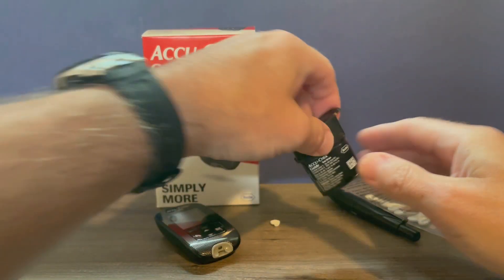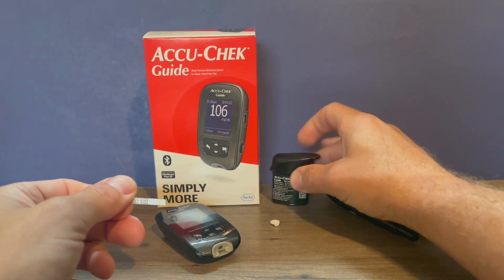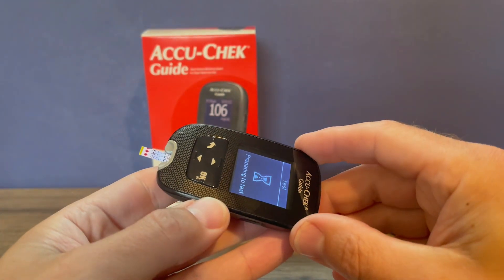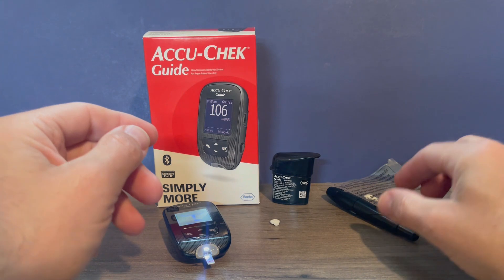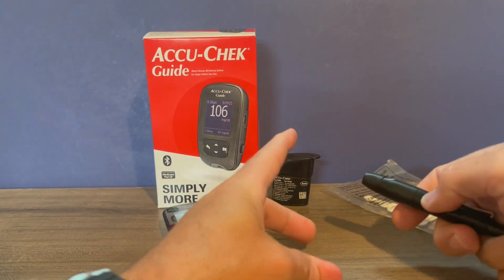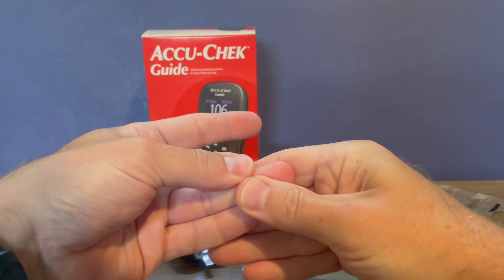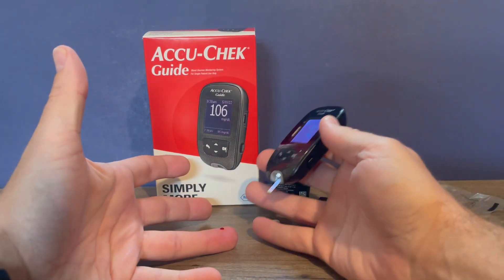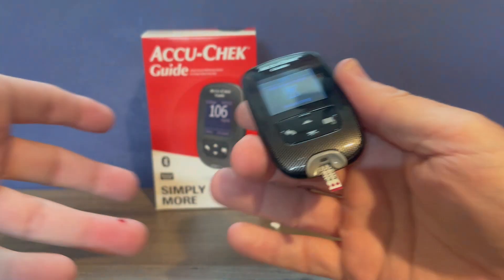Next, get a test strip. Open your vial — always leave your vial of test strips closed when you're not retrieving a strip as they can be sensitive to temperature and humidity. Insert the silver end of the test strip into the meter; now it's preparing and says it's ready for a drop of blood. Make sure your hands are thoroughly washed with warm soapy water and then dried. Charge the spring on your lancet device, place it on the side of a finger, push the button, and gently massage your finger if needed to ensure an adequate drop of blood. Then touch the end of the test strip to the drop of blood and it will be drawn inside the meter as the test begins.